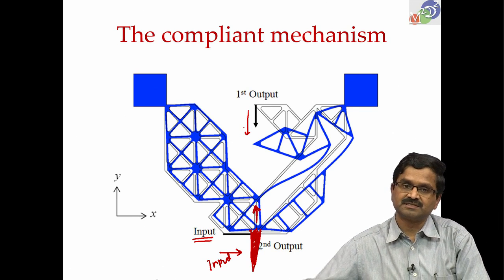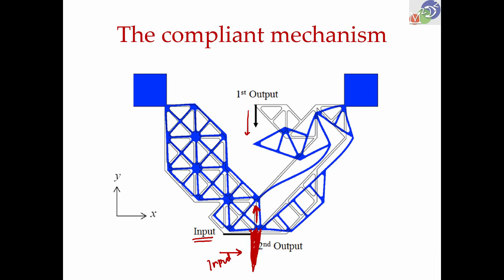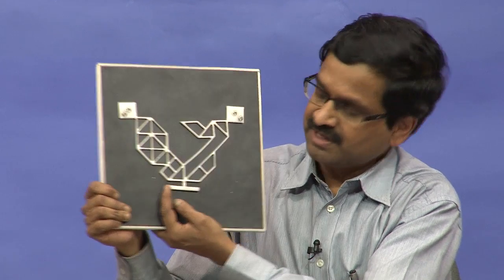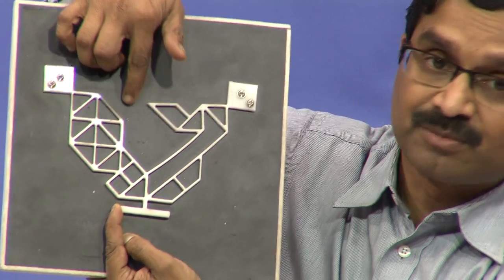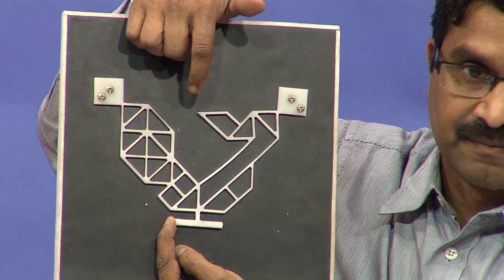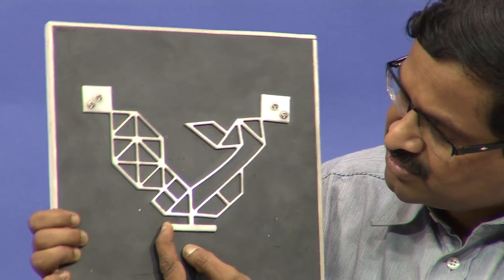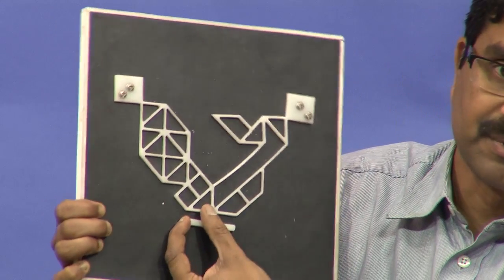So, let us look at this in a device. So, here is the thing we are talking about. Let me actually put it like this. Now when there is cutting force, so this way, I apply the force, you can see this coming down. So, this point comes down. By how much it comes down, we can estimate what the force is here. Okay, that is the force sensing principle. At the same time, when I do this, this also moves a little bit up. That is probably hard to see here, but this point actually moves up here.